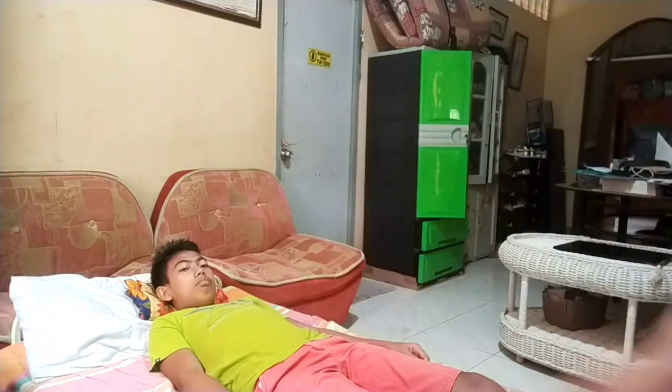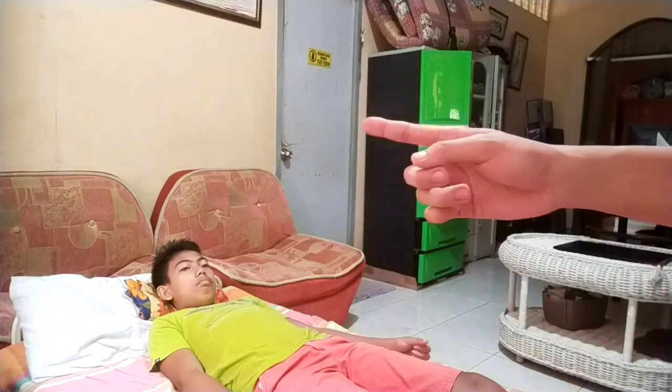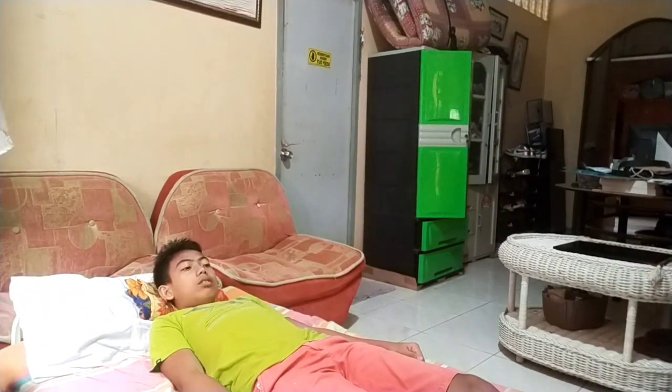So the next procedure is provide for client privacy. Since I've already closed the door and there's no curtains here, let's proceed to the next procedure. Position the equipment appropriately. Lower the bed to its lowest position so that the client's feet will rest flat on the floor. Lock the wheels of the bed.